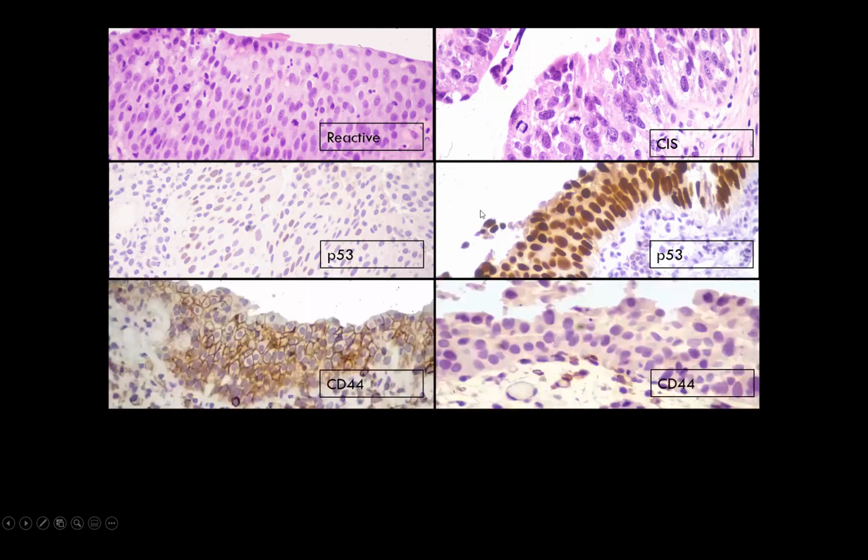So what about other stains? We have CD44. CD44 in reactive conditions should stain full thickness urothelium like this, right? Nice and intense. However, in carcinoma in situ, CD44 either stains only a few cells in the basal layer or does not stain at all. So this is a pattern you would expect in carcinoma in situ.